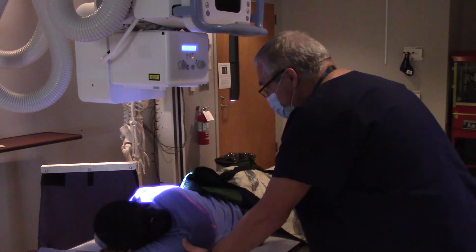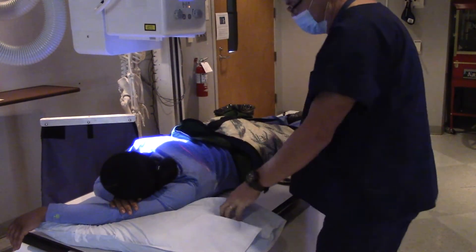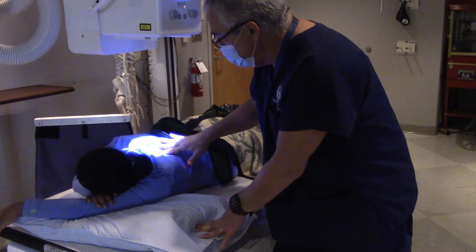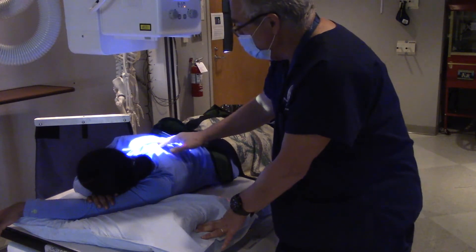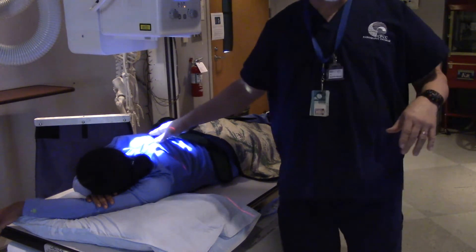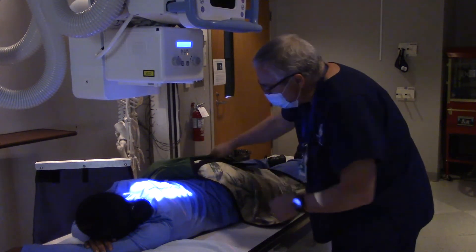We're not doing L-spine work here, this is something different. Now my patient has got crooked on the table — what I'm going to do is push her hip toward that back wall just a little bit. Ma'am, you just relax and let me do the positioning. Just straighten her out a little bit. Once again, aiming for the midline — going to be probably an inch or two above the spine. I want to make sure my light field is above her shoulders — the book says two inches above the shoulder. That's going to be good, at about the level of T6 once again. Using that inferior angle works so well — that's probably your best bet for positioning. I want to make sure that my shield is not in the light field, that would mess me up.